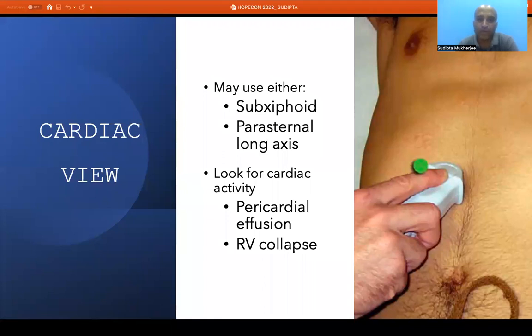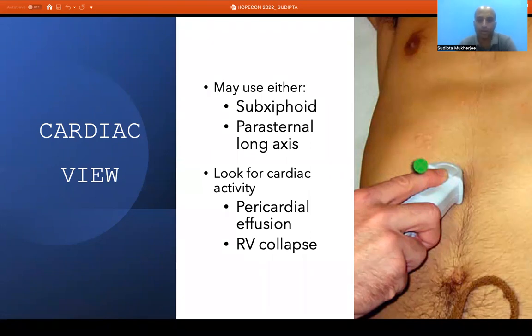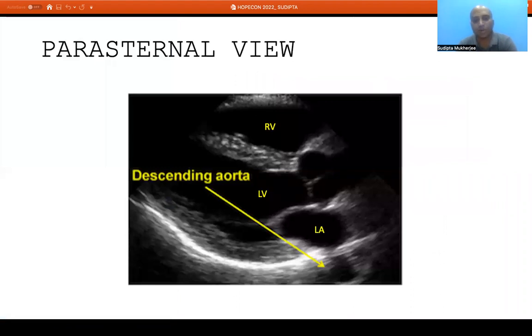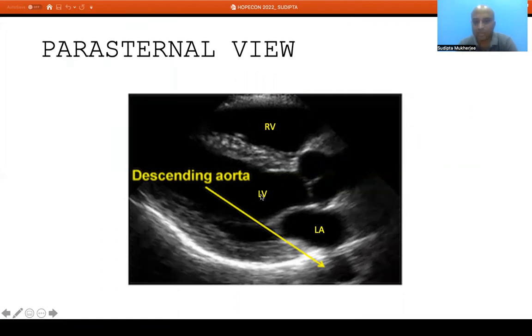For the cardiac view in FAST, we obtain the window from either the subcostal or the parasternal long axis. We look for cardiac activity, pericardial effusion leading to cardiac tamponade, and right ventricular collapse. The subcostal probe is placed in the epigastrium with the indicator towards the patient's right shoulder. This view can be difficult in patients with significant abdominal pain or obesity — in that situation parasternal long axis is preferred. In the parasternal long axis we identify the left atrium, left ventricle, left ventricular outflow tract, right ventricle, and the descending aorta. The shiny pericardial structure helps identify pericardial fluid above it versus pleural fluid below it.